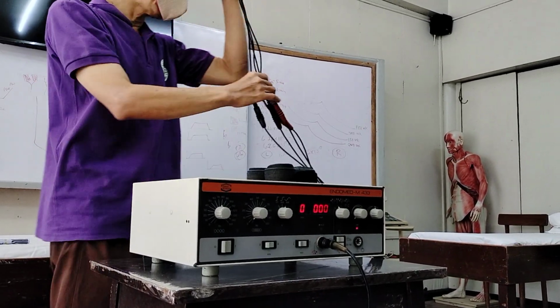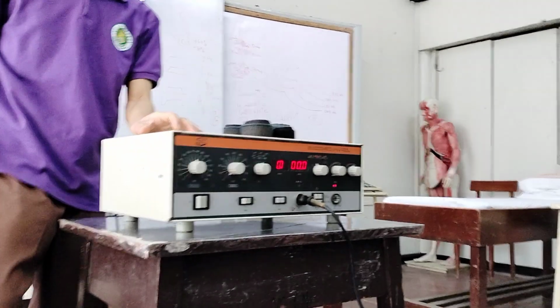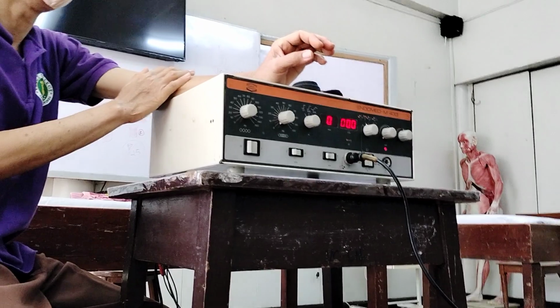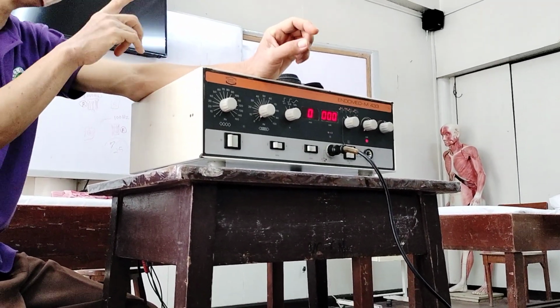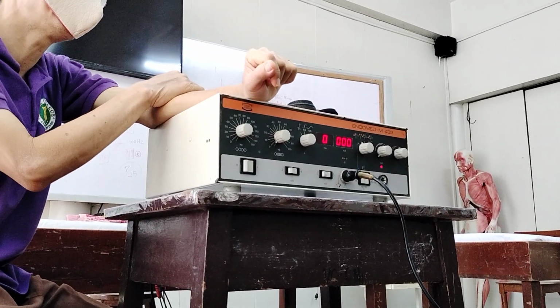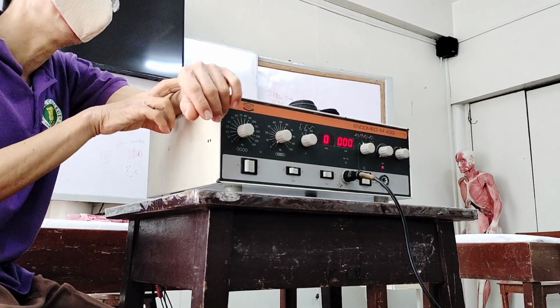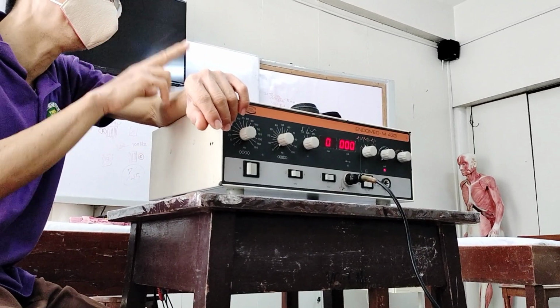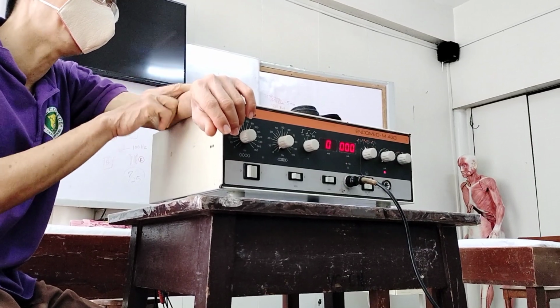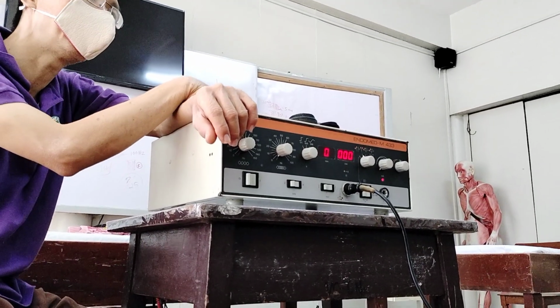Okay, so with regards to your bipolar or two-pole method, the advantage there is that one, it's easy to apply. Kaya duha man ka-electrode, di mo siya upat. So you mentioned this is for pain relief, diba? Kung asa ang painful side, you can place your electrodes on the sides of the painful area, or perhaps one electrode is placed directly over the painful area, then the other electrode will just be placed adjacent or tupad na niya. So yan, easy apply sa bipolar two-pole electrode.